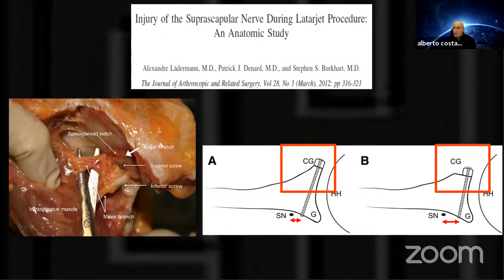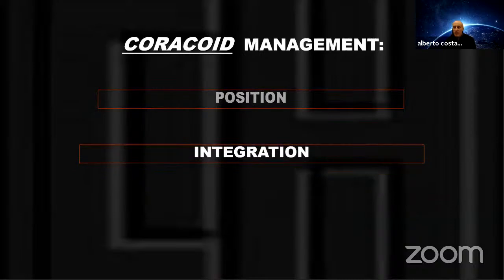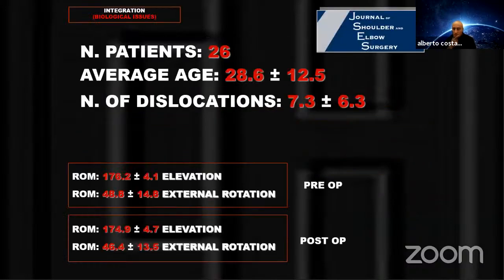So remember, this is one of the reasons, because we want to stay parallel to the glenoid surface. So remember to be in line with the cortex when we do this kind of Latarjet. So measure the distance, the depth of the glenoid. The other problem of this kind of surgery, the Latarjet, is the integration.